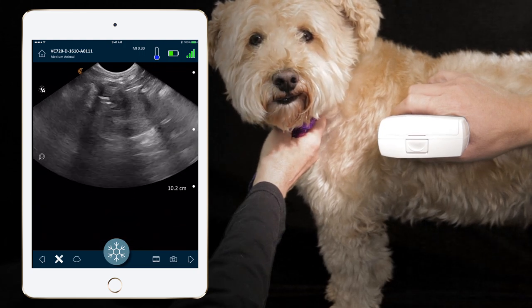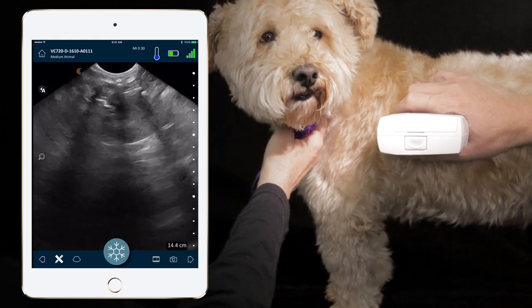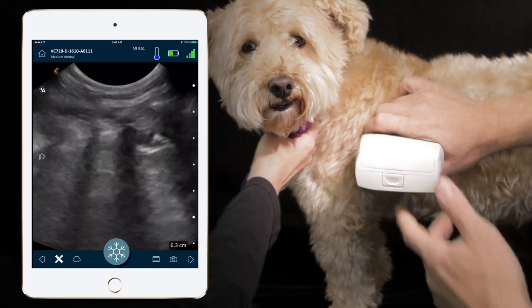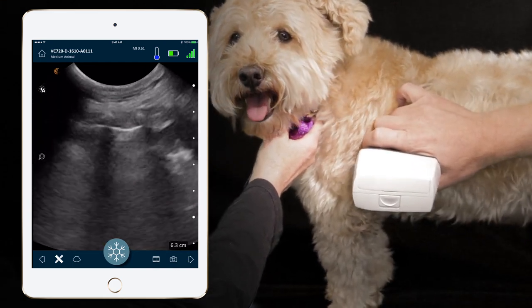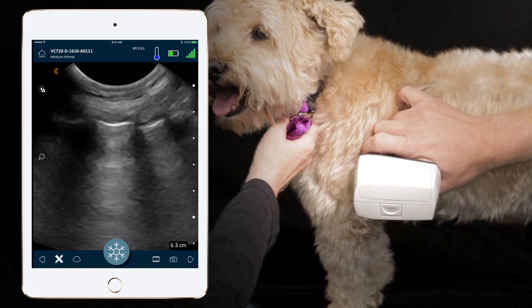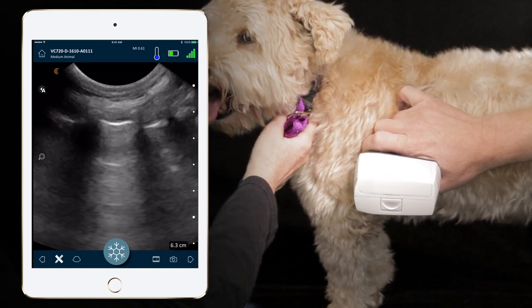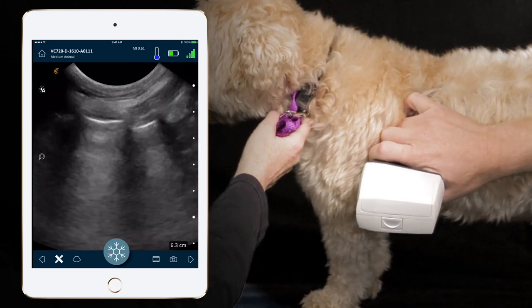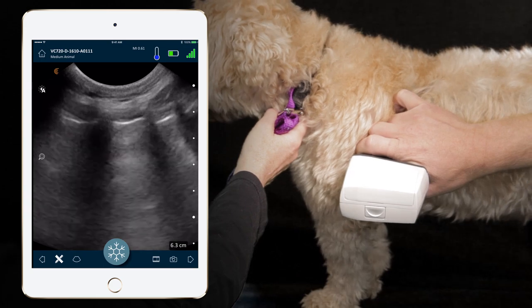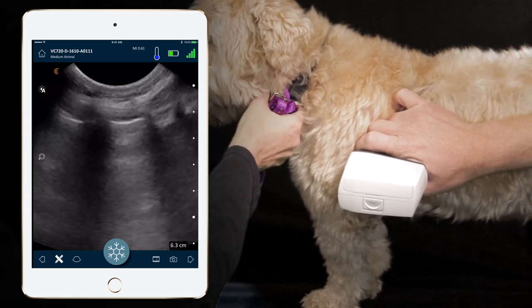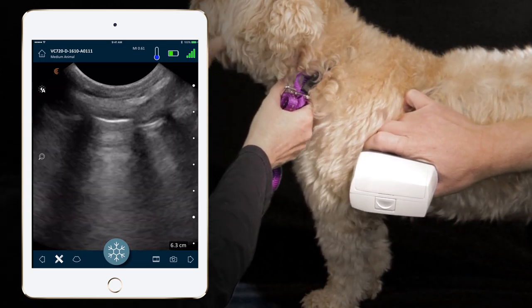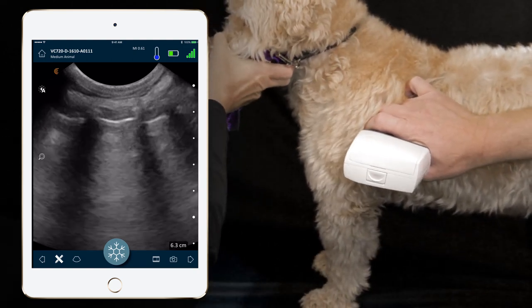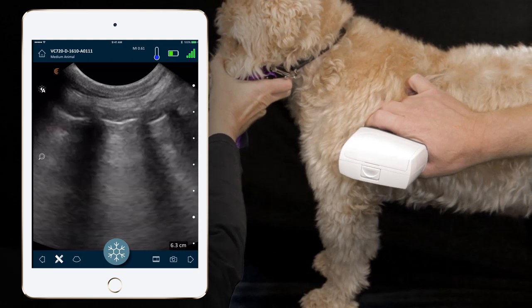We're going to adjust our depth to roughly six centimeters, and what we're trying to do is pick up our landmarks. Essentially, we're looking for the ribs with rib shadowing, as we can see here, and that first white line after the rib shadows and the margins of the ribs is going to be our parietal pleural interface — similar to the FAST exam of the thorax, where we look for that parietal pleural line and shimmering.